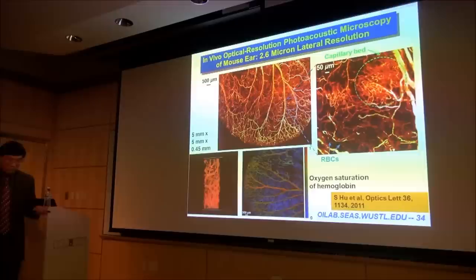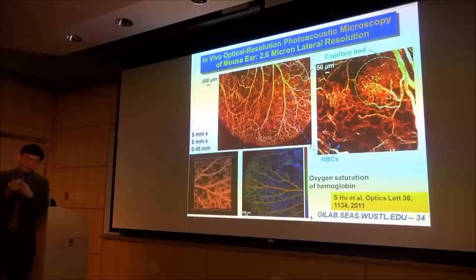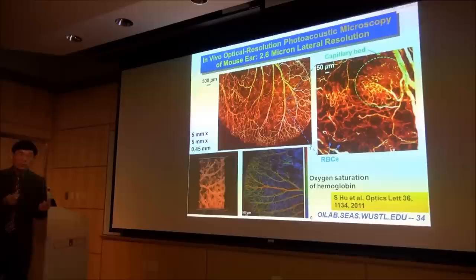You might have heard of pulse oximetry. That's based on that principle. They use two wavelengths to figure out the oxygen saturation. But in pulse oximetry, they go through the fingertip, for example. So very thin objects, works in transmission mode, volumetric. They don't resolve vessels. They only allow you to sense arterial blood. So there's no measure of venous blood, which is actually sometimes very important in terms of quantifying oxygen delivery.